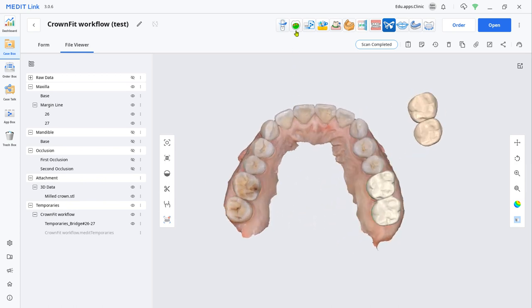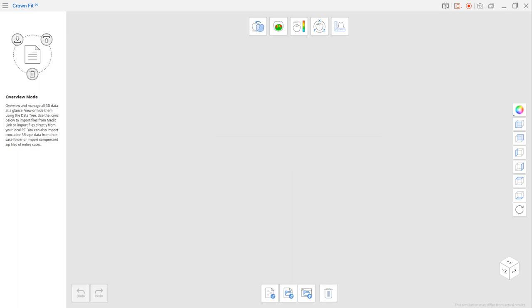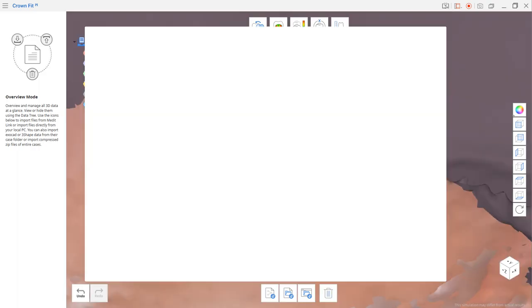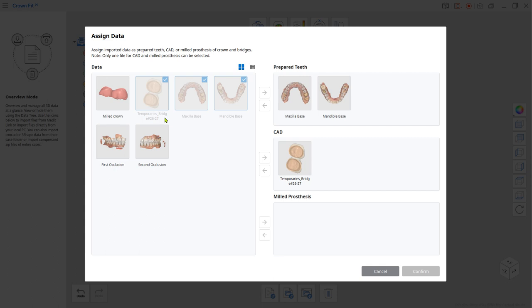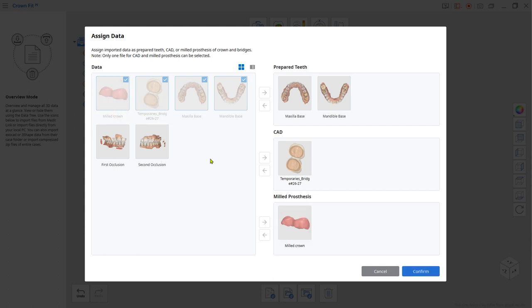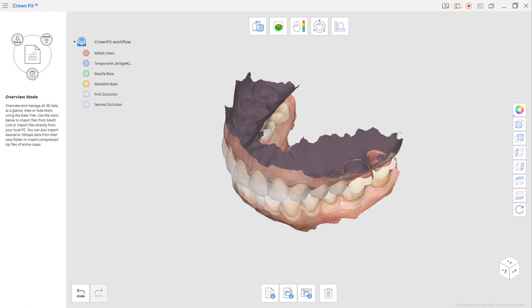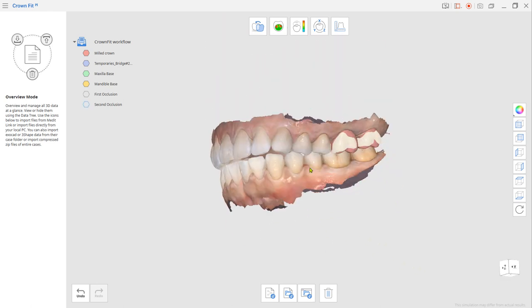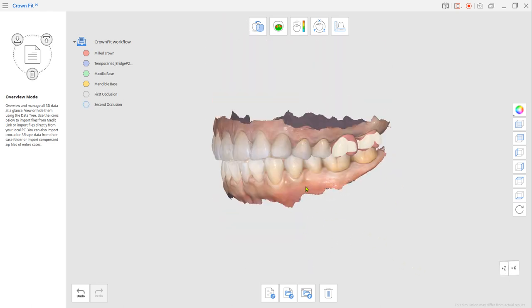Now load those files to the crown fit. Assign the temporary crown as a CAD data. As soon as files been loaded, two CAD and milled crown data are supposed to be aligned automatically.